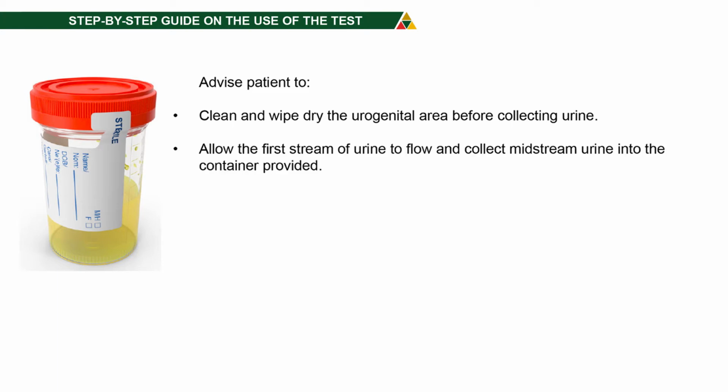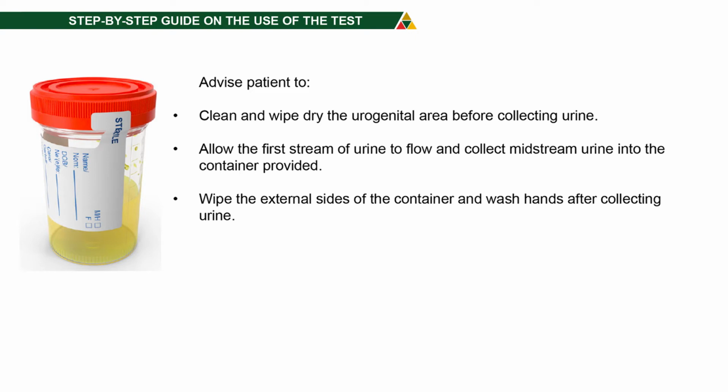Ask the patient to collect midstream urine by allowing the first bit of urine to pass before collecting the urine in a sterile container that has been provided to the patient. The patient should wipe any spillage on the outside of the container.